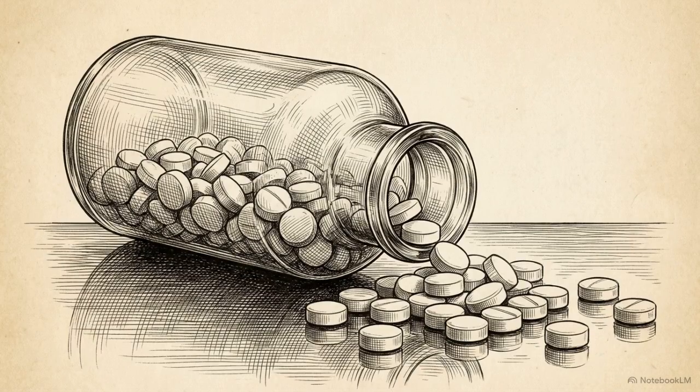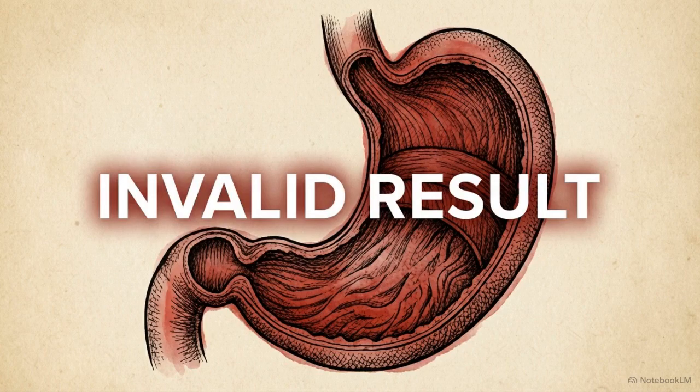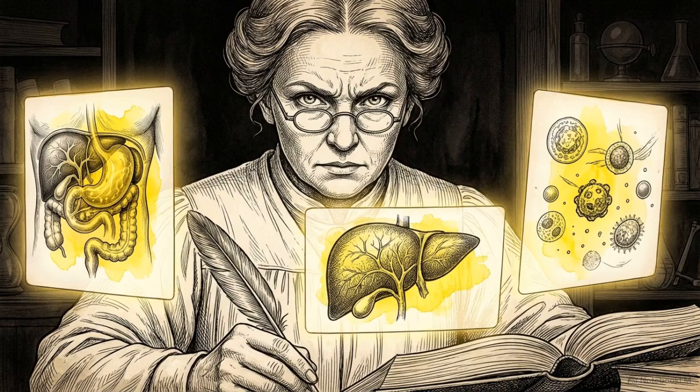Certain medications will also invalidate the test entirely. Prokinetic drugs like Reglan accelerate gastric emptying, causing a false negative. Opiates delay gastric motility, causing a false positive. Accurately diagnosing gastroparesis means isolating the stomach's true mechanical grinding rate from positioning errors and drug-induced illusions.